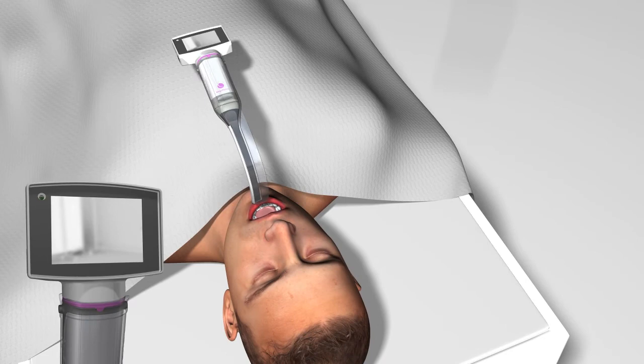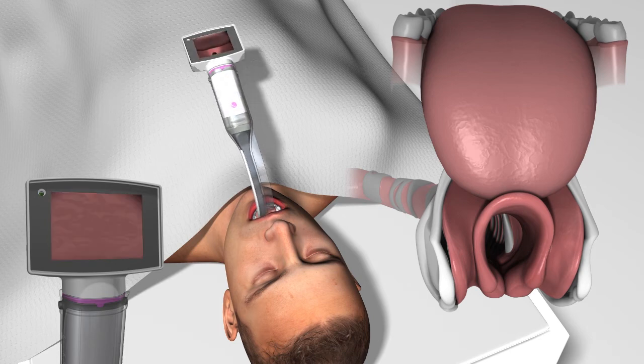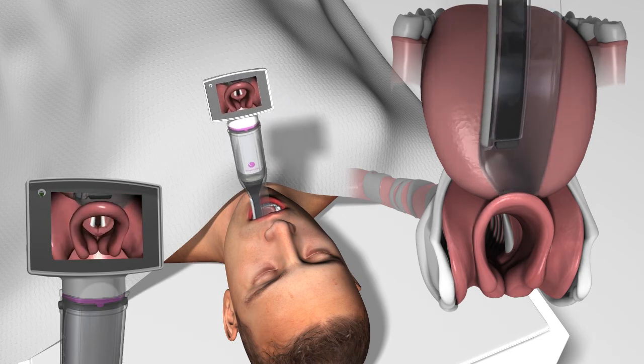Insert the blade into the mouth following the midline. As the blade advances into the oropharynx, use an anterior approach toward the base of the tongue. Watch for the epiglottis and direct the blade tip toward the vallecula to facilitate visualization of the glottis on the display screen. The tip of the A blade can be placed in the vallecula like a Macintosh blade, or it can be used to lift the epiglottis like a Miller blade. For best results, center the vocal cords in the middle of the video screen.